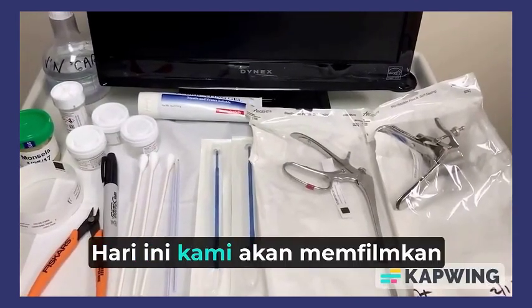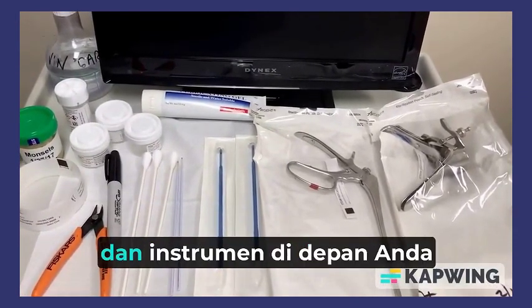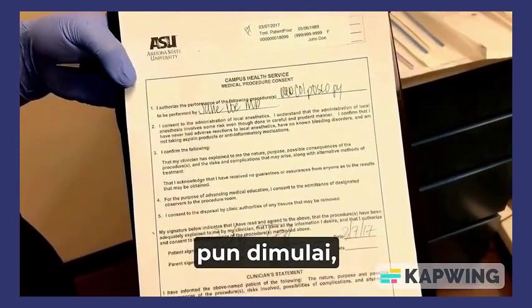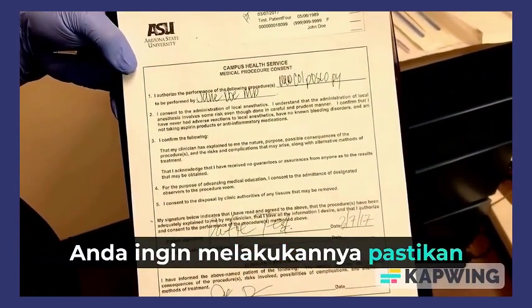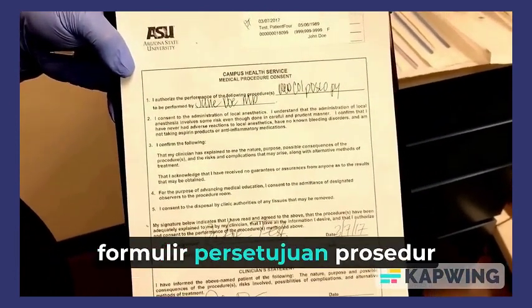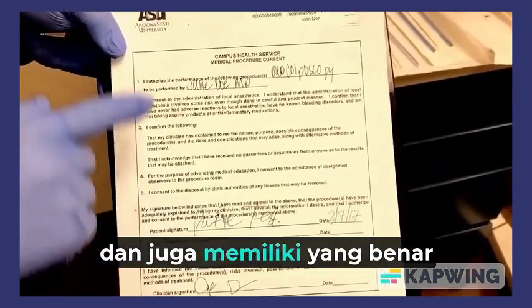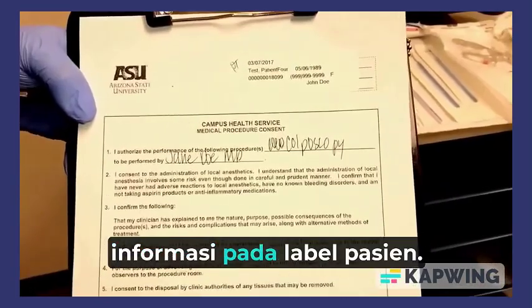Today we will be filming a demonstration of a colposcopy, and the instruments in front of you are the ones that we will be using today. Most importantly, before any procedure is started, you want to make sure that you have the medical procedure consent form filled out by the provider, signed by the patient, and also has the correct information on the patient label.